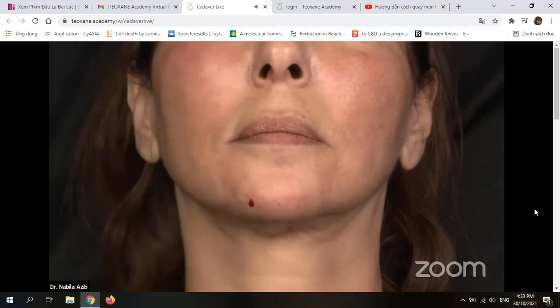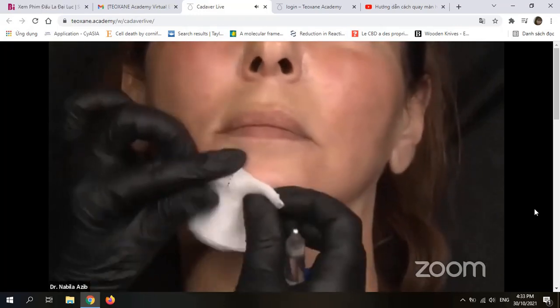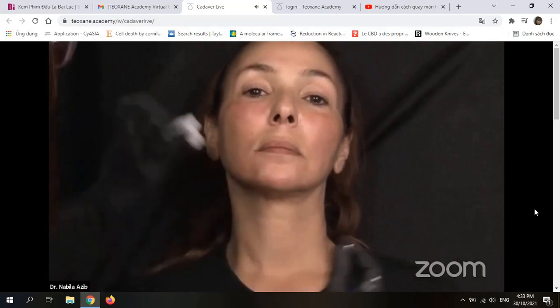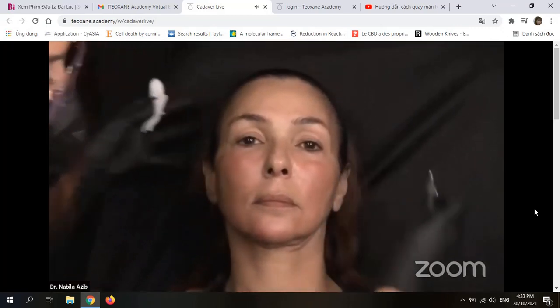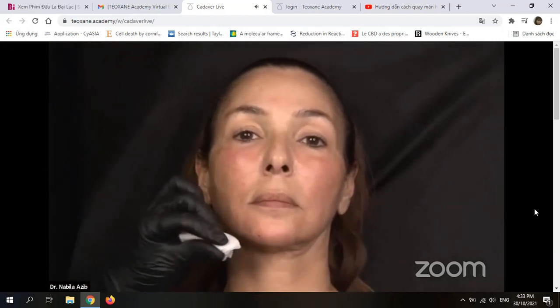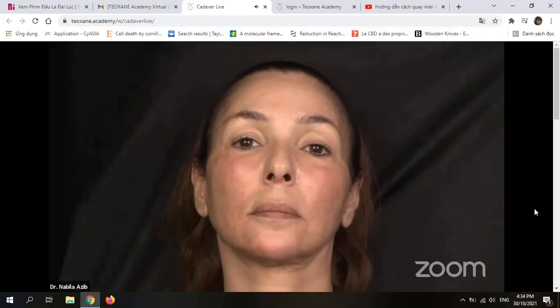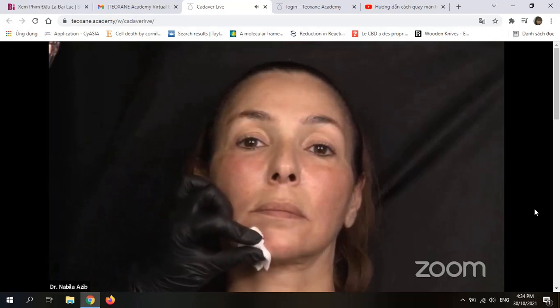So let's see with a zoom out the total result on this side. Yes, great result. Thank you. Now the lips, Ludmila.